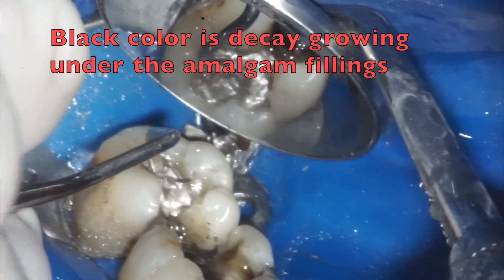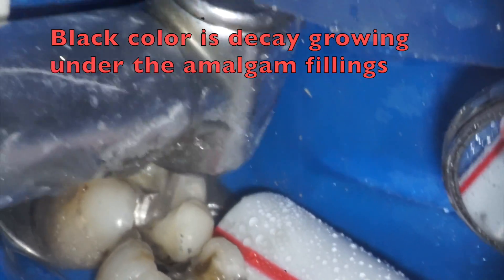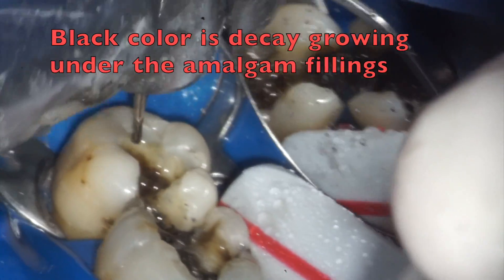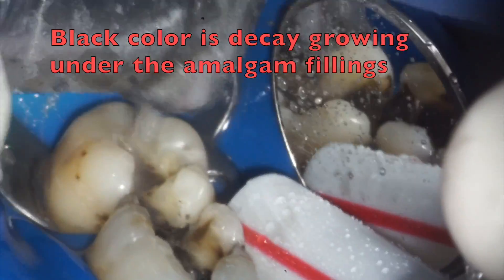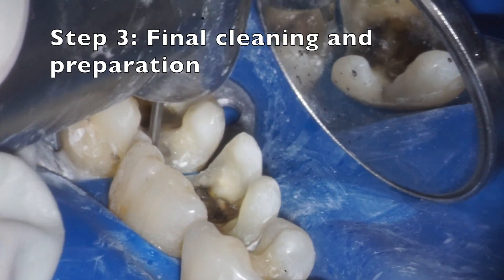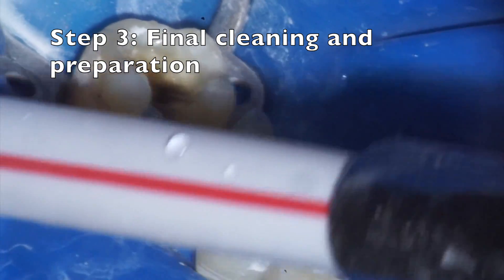Now we can see how much decay was growing underneath the amalgams. All of the black color that you see is decay, and now that all the decay is removed, we're doing our final preparation for the fillings.